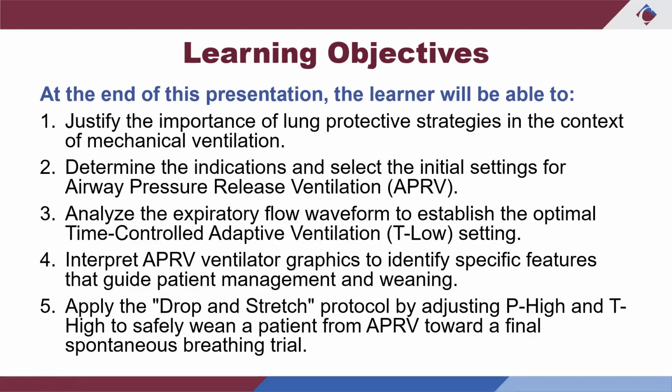And then we're going to analyze the expiratory flow waveform. And again, this is where TCAV comes into play, because TCAV is the fine tuning of the time low, how to set it correctly based off lung pathophysiology.